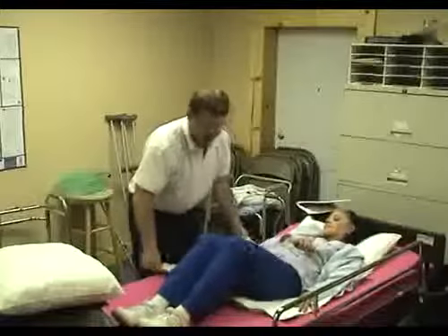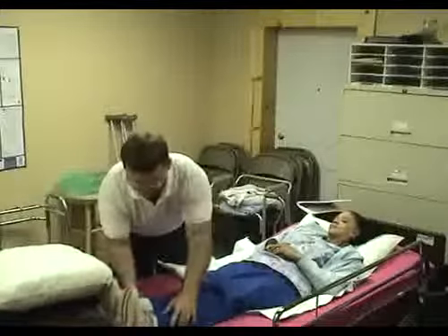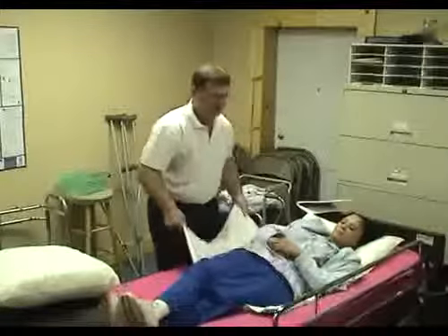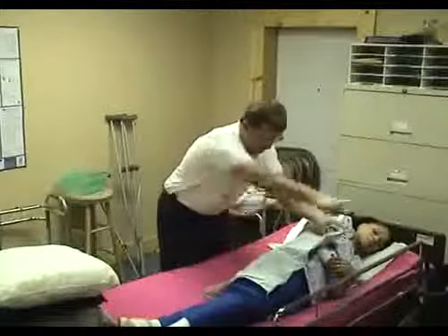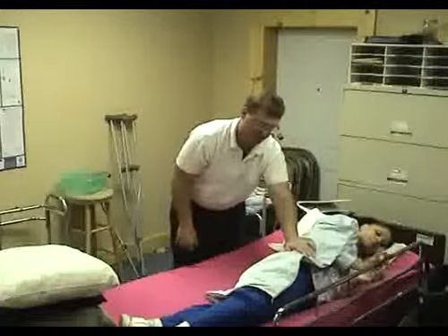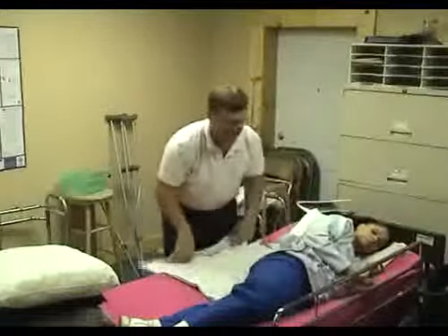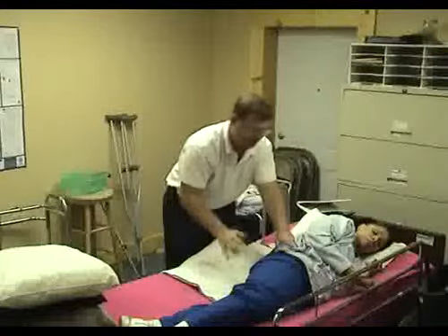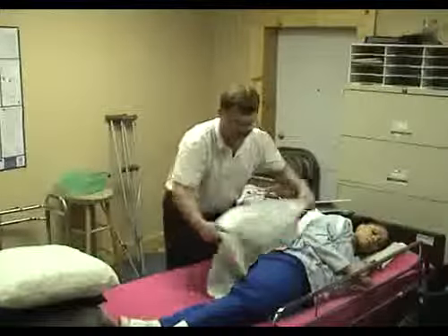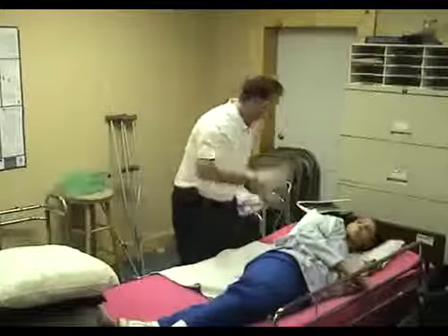Now, if we're using this as a draw sheet to assist the patient to turn, what I like to do, and they can't hold their legs up, is cross the legs. Don't do anything. And just pull it towards you. And give it a nice, firm but smooth, pull over to the side. And that'll help get them over to the side, especially when you're back here and you're trying to get the patient cleaned up from behind, when you're trying to put diapers on, take them off. When you're changing bed linens, what you would do, we'll get to that. It's easier to use this whenever the patient's in bed.